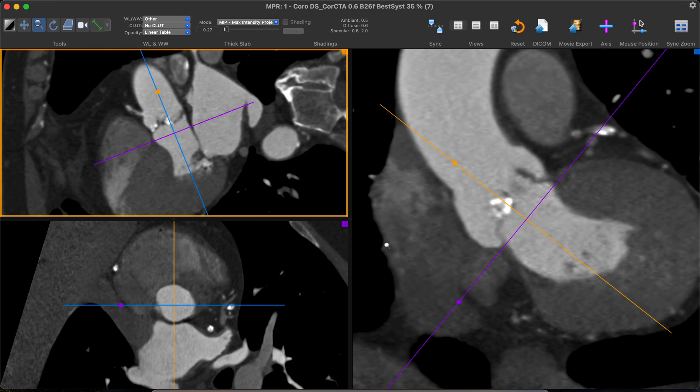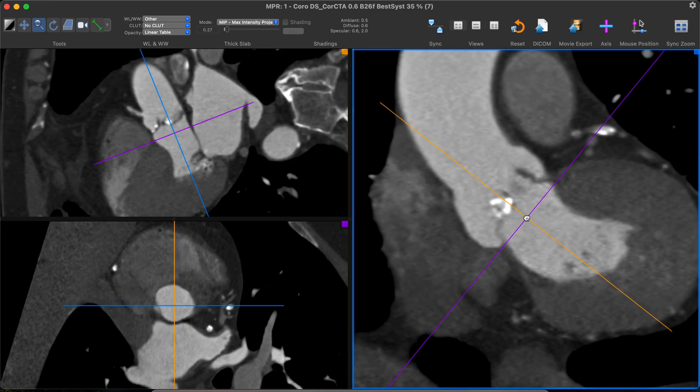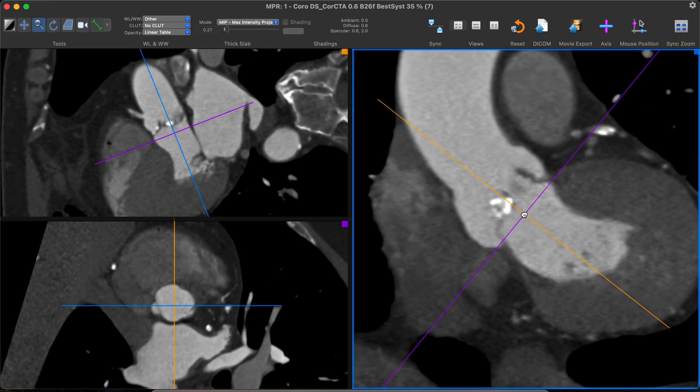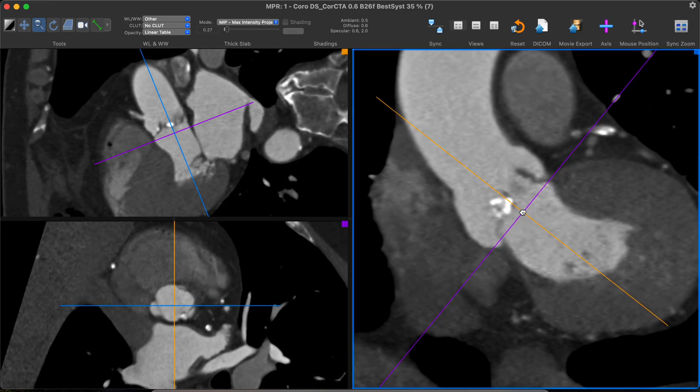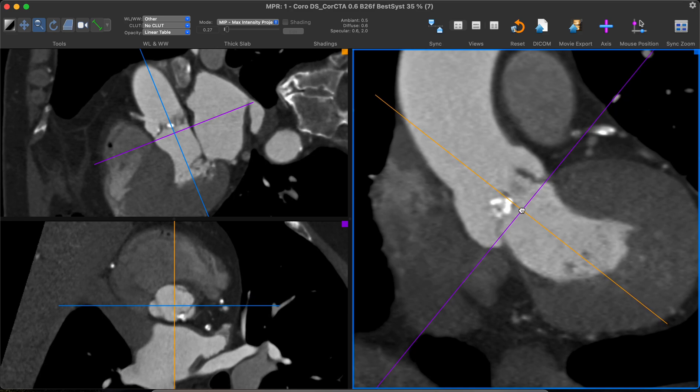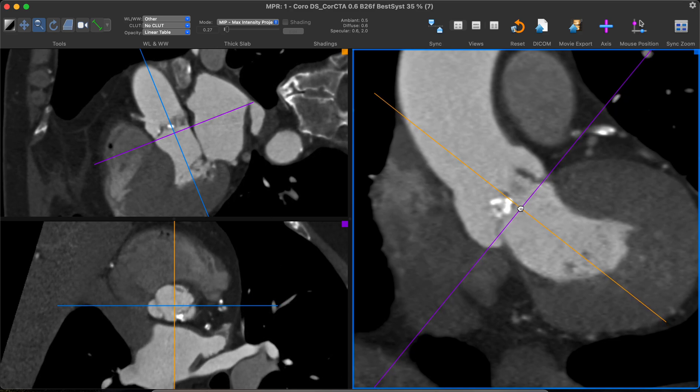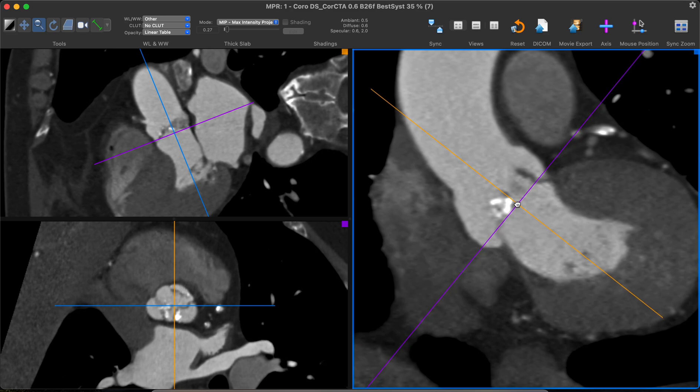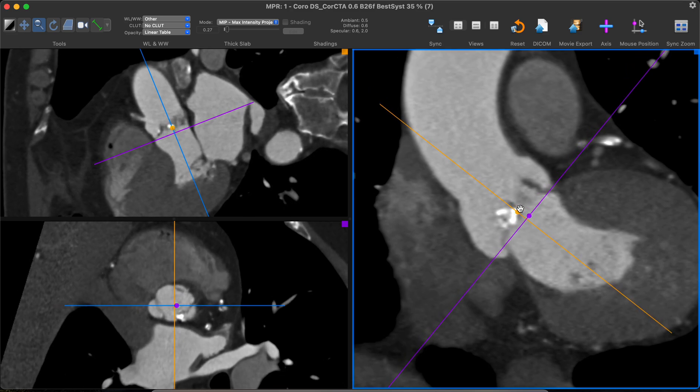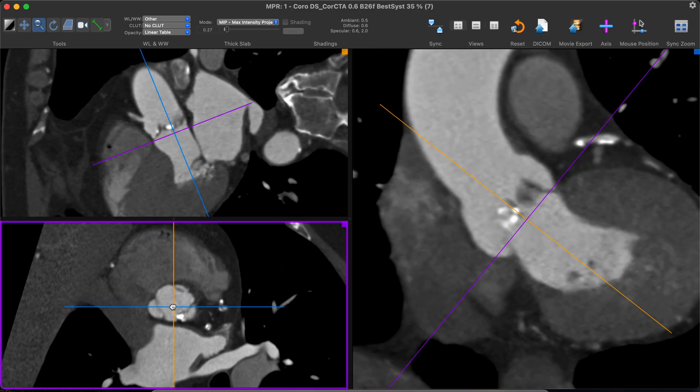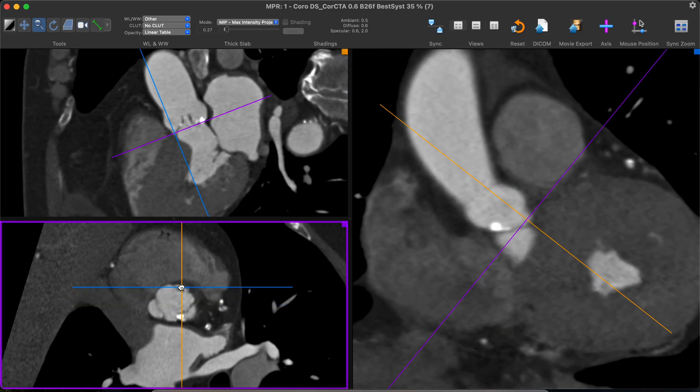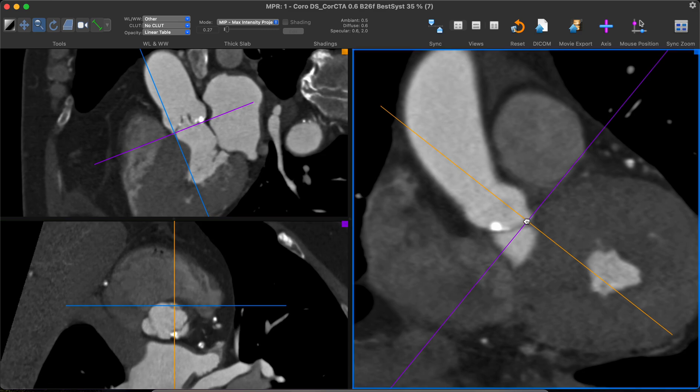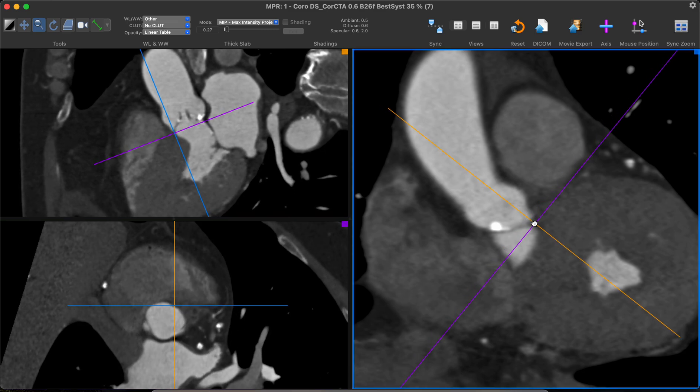So the first thing that we do now is that we move the axis along the aorta, and our eyes are fixed on the purple window down on the left till we see the right coronary cusp is appearing. So here, this is the right coronary cusp. We move our axis over there, and then we adjust it to be just at the nadir.